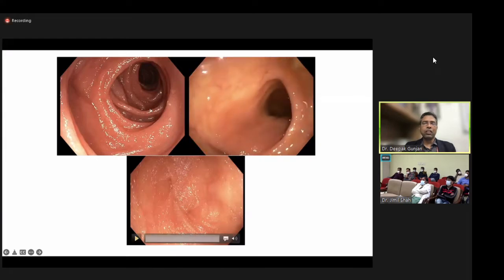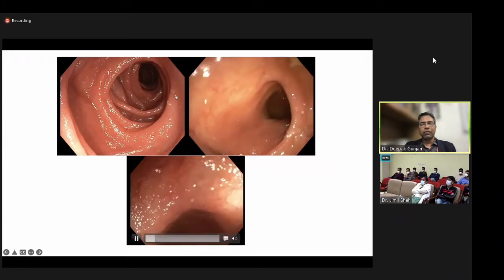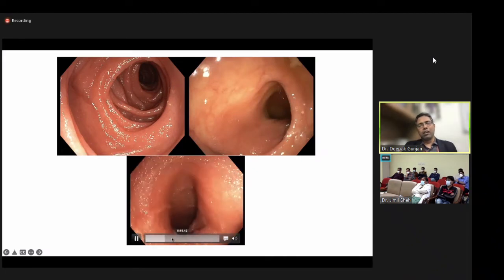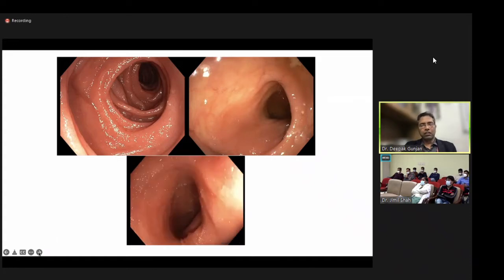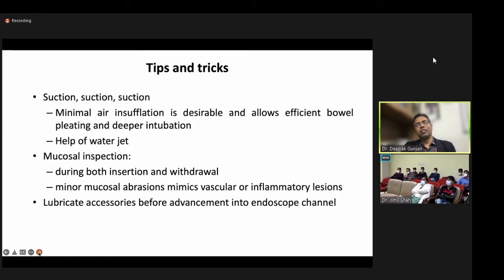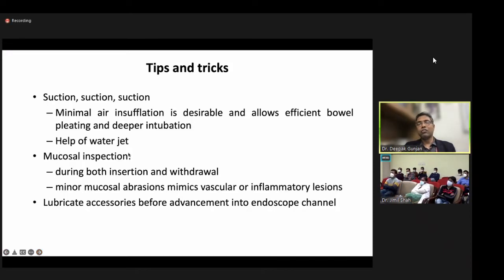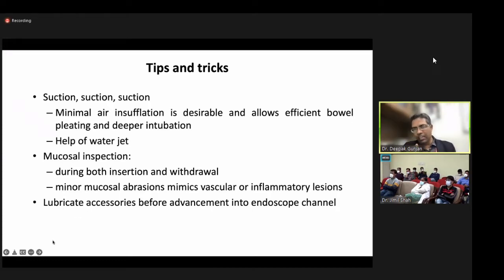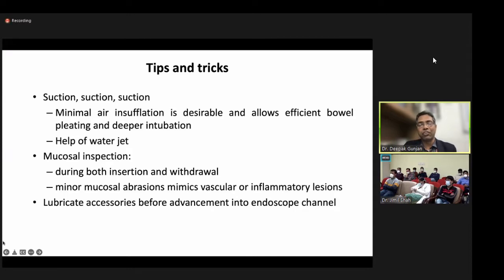Various enteroscopic images: the proximal jejunum shows circular folds; entering the ileocecal junction by retrograde approach takes many attempts. The difference between the ileum and jejunum is visible — jejunal folds are absent in the ileum, and villi are shorter in the terminal ileum. Tips and tricks: use minimal air or CO2 — suction repeatedly. In spiral enteroscopy, beyond the DJ flexure, stop using CO2 and use water only. Always perform mucosal inspection both while advancing and during withdrawal, as mucosal abrasion mimics vascular or inflammatory lesions.